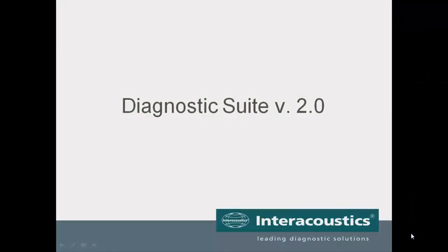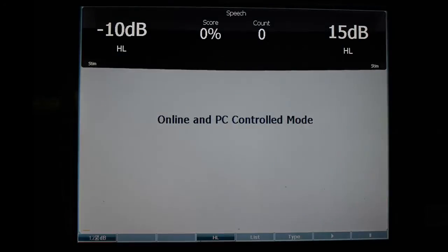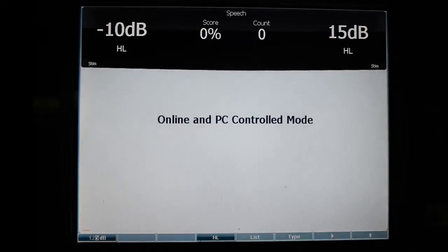When running in hybrid mode, the AD629 and the AC40 will now show the intensity and frequency information on the top of the display screen on the device, whereas before it just said PC controlled and online mode.